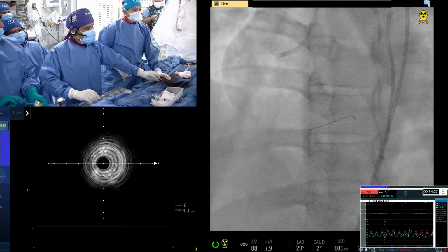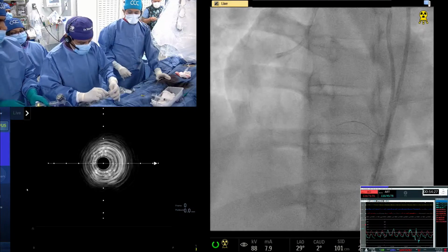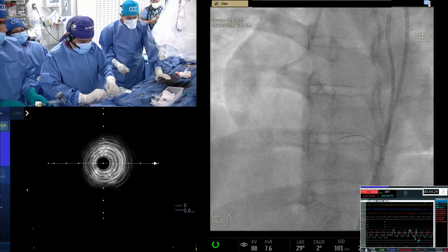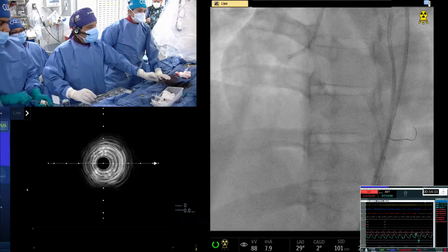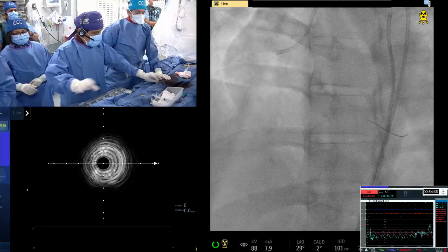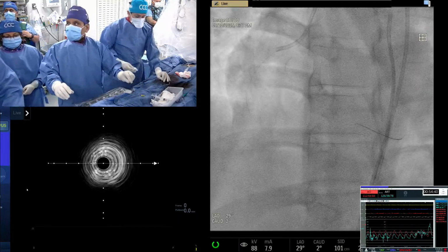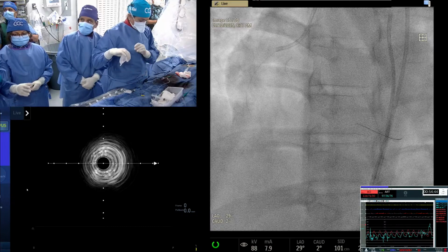So the balloon is anchoring you. No balloon. One second. Why did this happen? Inflating there. Yeah, just the inflator to our fine cross, and it will come out. Done. So single wire, just fine cross, you inflate and it comes out.